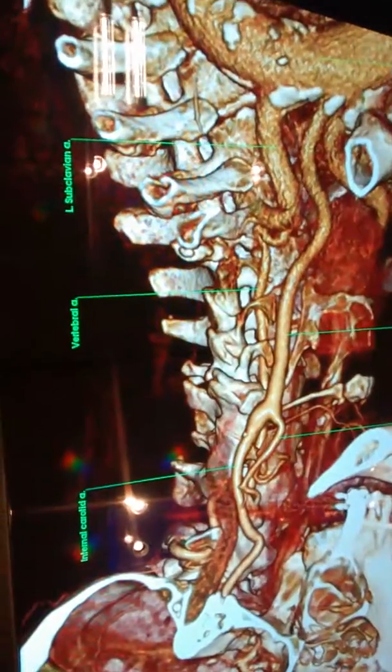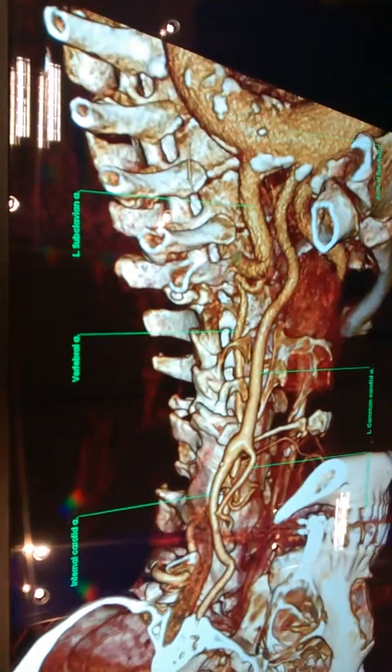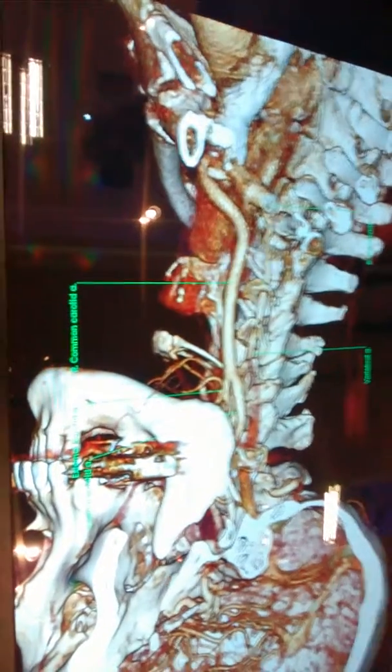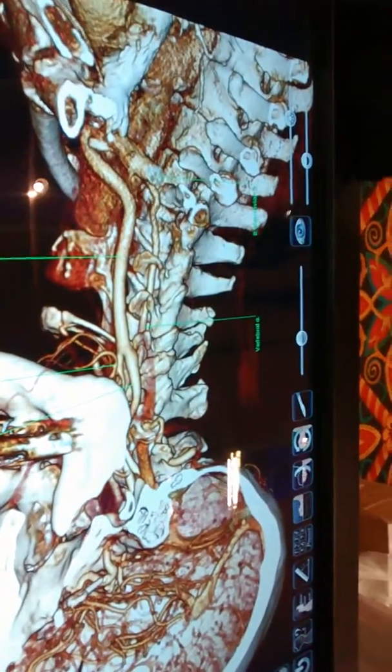And we worked alongside Stanford. They were one of our earliest allies for this project. That's where we got the majority of the scan data from, as well as the curriculum project here. And you have a website? We do. It's www.anatomage.com. You can go into the medical section there. It has the table gallery, a lot of videos of the table's functions, things like that, where it's being used.